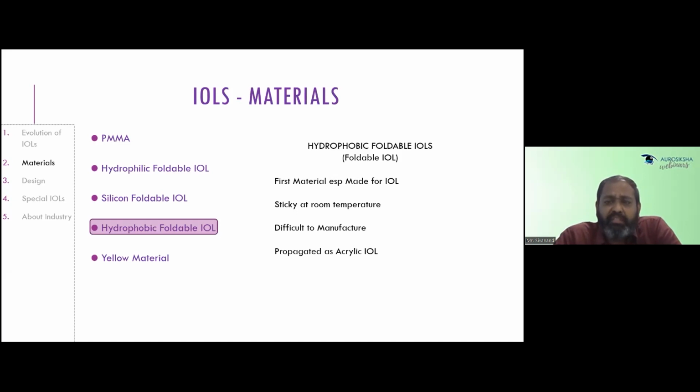It is commonly referred to as acrylic lens, but even the PMMA, the hydrophilic, and the hydrophobic, they are all part of the acrylic family of plastic. Acrylic is basically a plastic family.